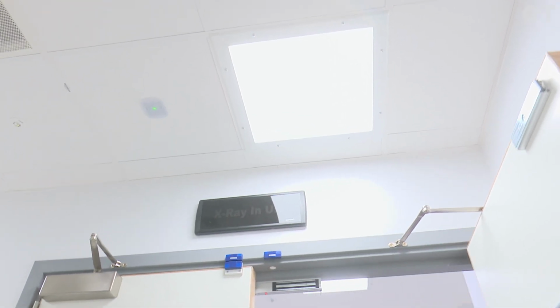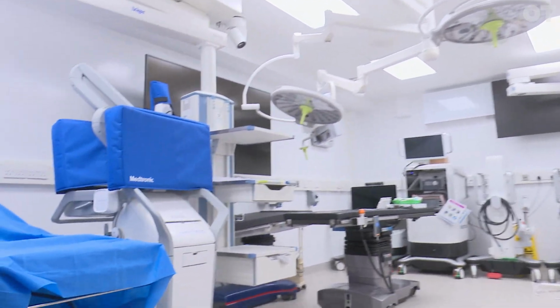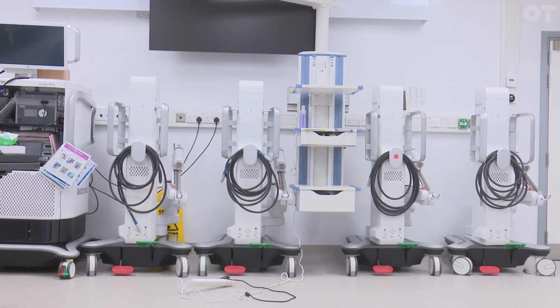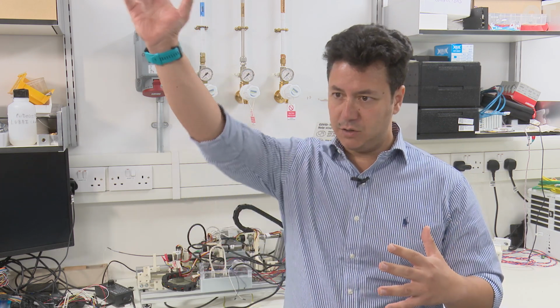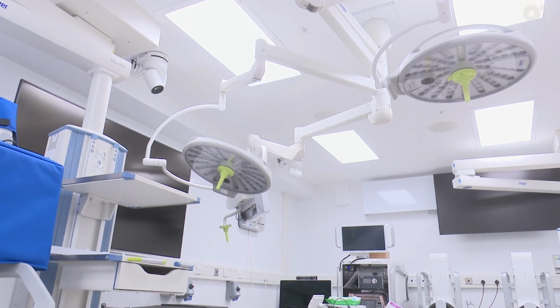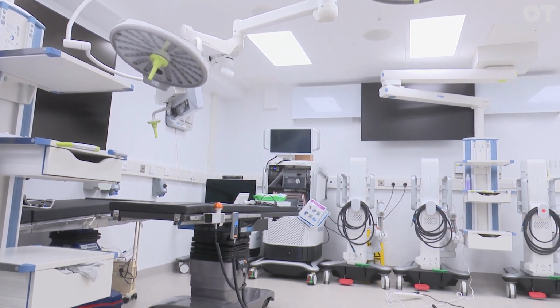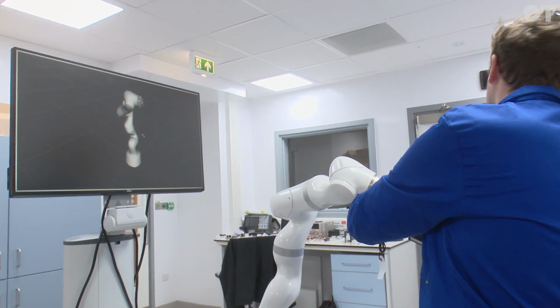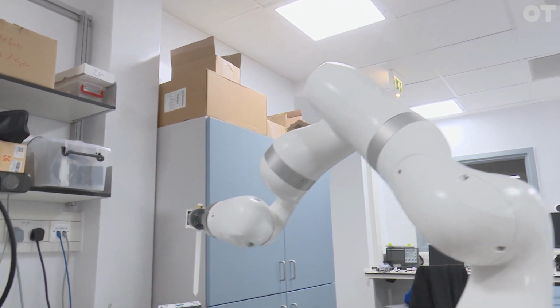The operating room of the future will be an environment where artificial intelligence agents, robotic agents, and human agents work collaboratively to improve healthcare delivery. You can imagine that you will have a sensorized operating room with cameras mounted on the ceiling and sensors on the instruments, and some sort of 5G or 6G protocol where all these machines, through what we call the Internet of Medical Things, communicate with each other, share data, and then the artificial intelligence supports surgical decision making.